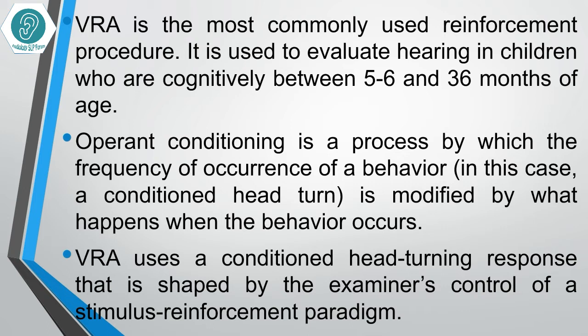Operant conditioning is a process by which the frequency of occurrence of a behavior is modified by what happens when the behavior occurs. VRA uses a conditioning head-turn response that is controlled by the examiner's control of a stimulus reinforcement paradigm.